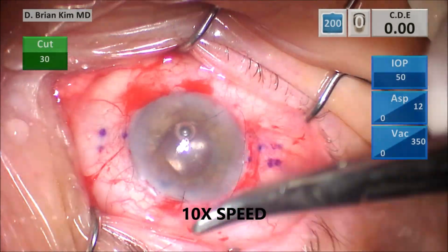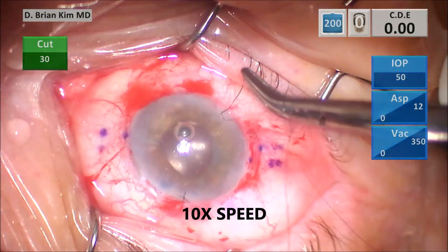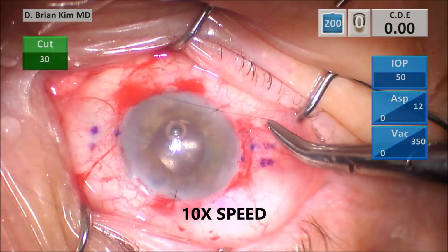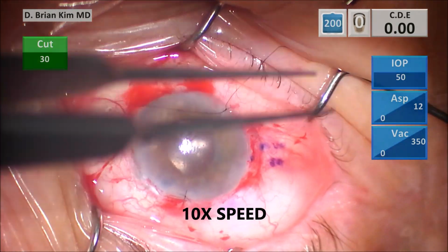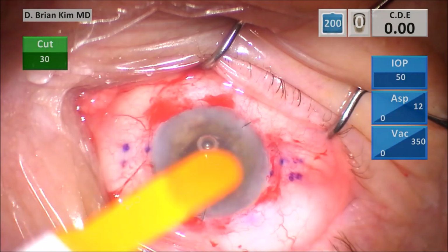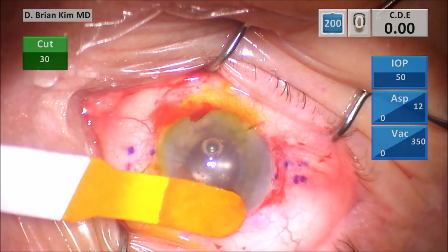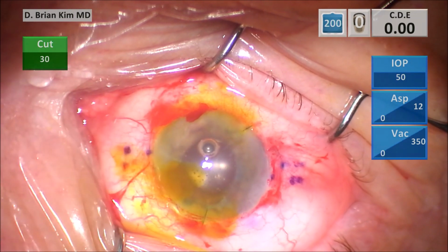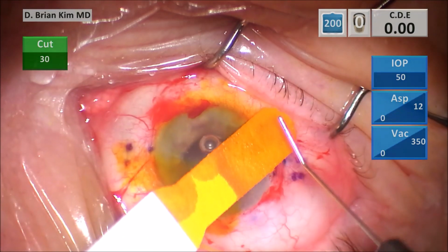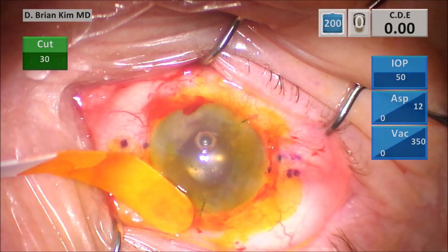And this suture I have to place is through the AC maintainer. It was leaking a little bit. And so, of course, if you have a leaky incision, you've got to deal with it. That AC maintainer incision is pretty tight. And again, you saw me wiggling it down, and it works great in that context because it's a nice tight incision during the case. But sometimes when you have to really put force in, it does cause it to gape. So I go ahead and place that suture in at the end.